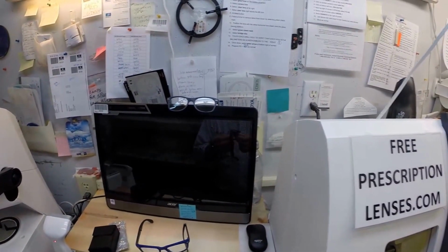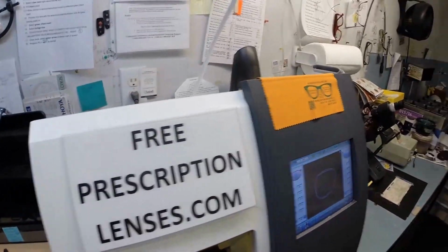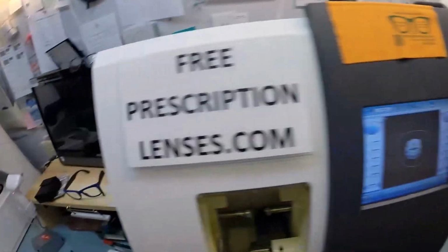Get off of there. Tuck it in at the outside corner, then using the thumbs, press down at the nose, it snaps in easily. Now let's do the same thing for the left lens. Put that in there, flip that over to L, hit start.